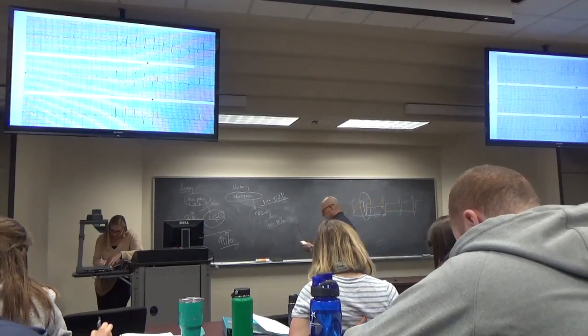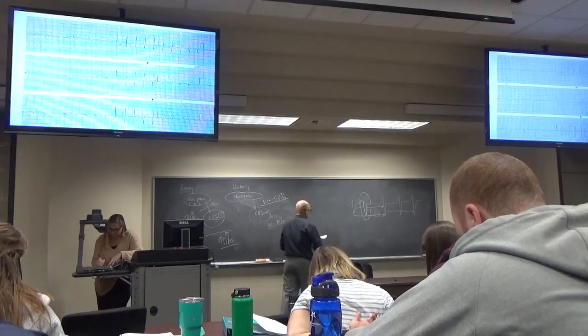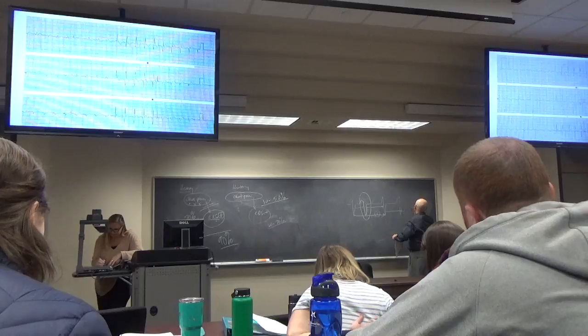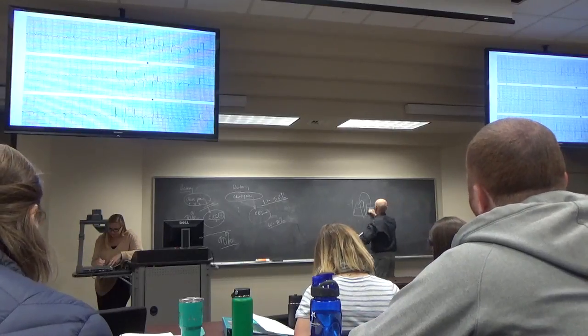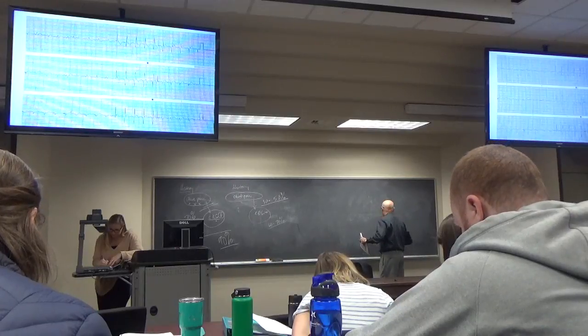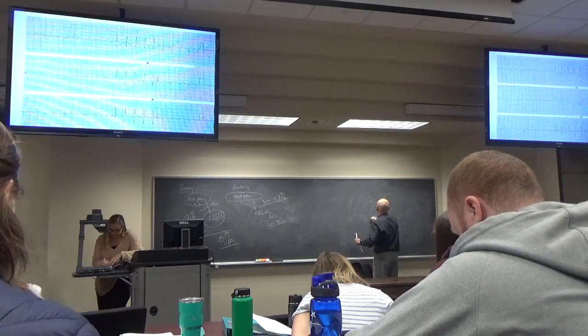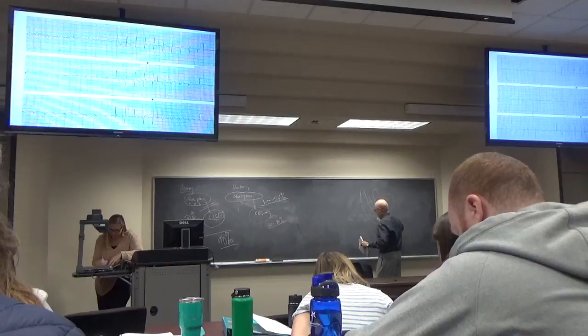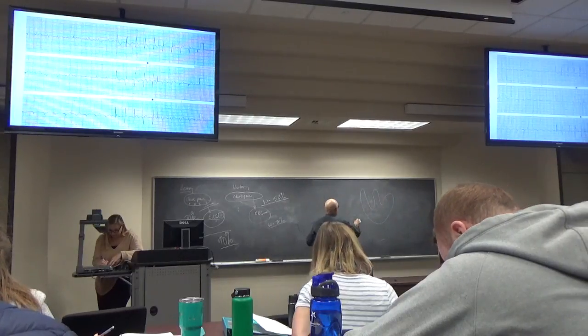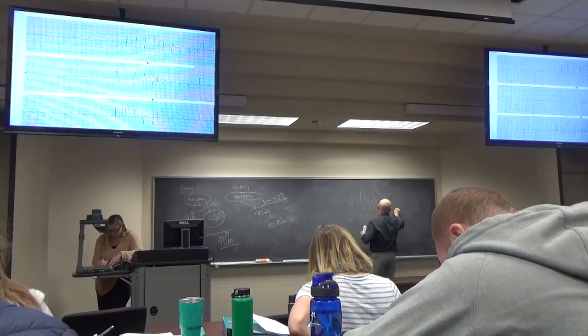V1 through 4. So V1, V2, V3, V4. And then also some ST elevation in V5. And then Q waves in V1 through V5. So then that would be anterior septolateral infarction. And I said it was age indeterminate in V1 through V4, and then acute in V5.